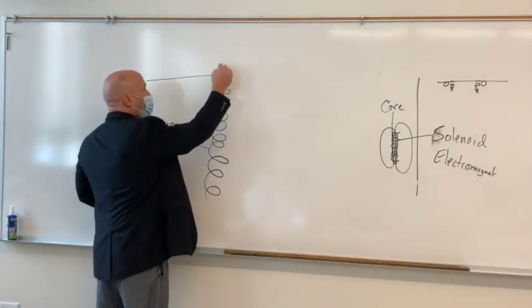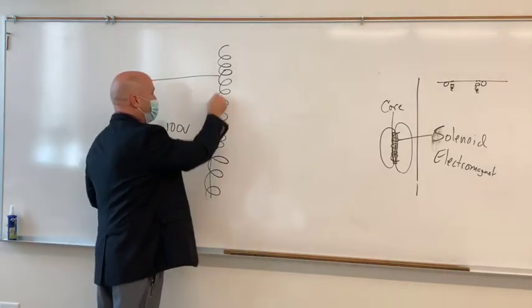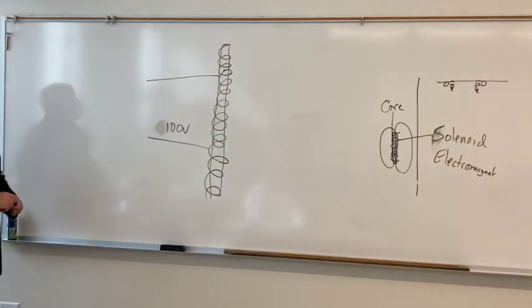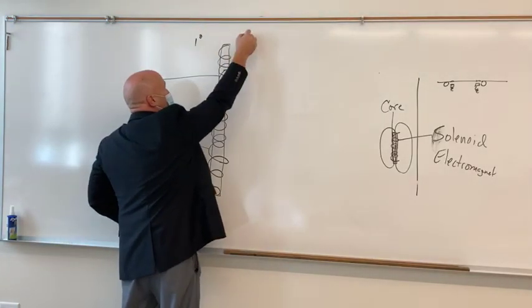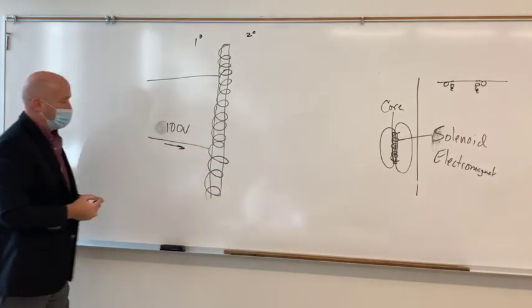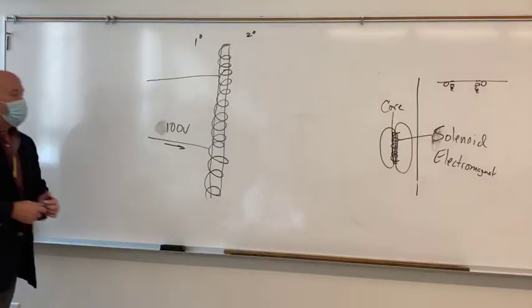The contacts on the primary side are set, and your auto transformer is nothing but an electromagnet, really, because it's got an iron core in it. So what we have is two sides to it. We've got a primary side and we've got a secondary side. Now, if we supply electrons to this, what do we create? We send electrons through it. Electricity goes through the coil wire. What do we create? Electromagnetism. We create magnetism. We take electricity and we create magnetism.